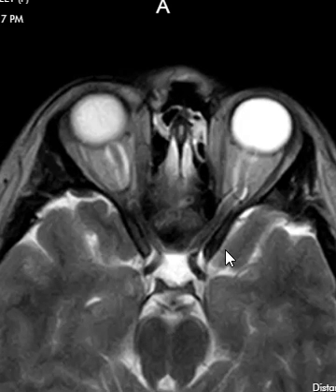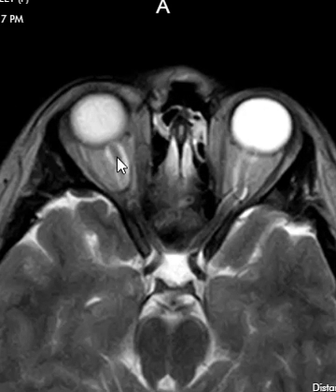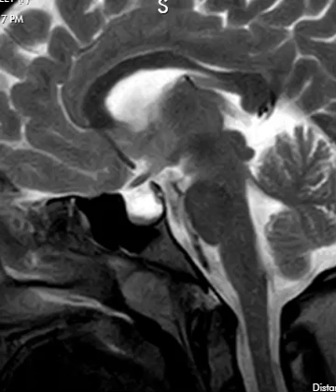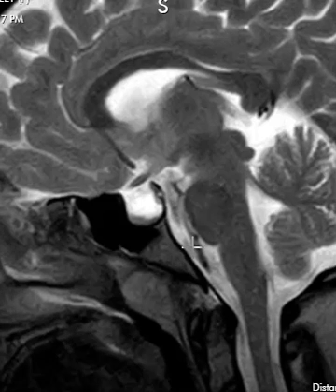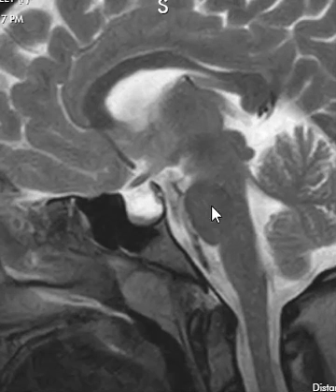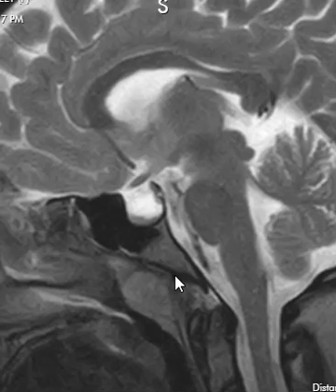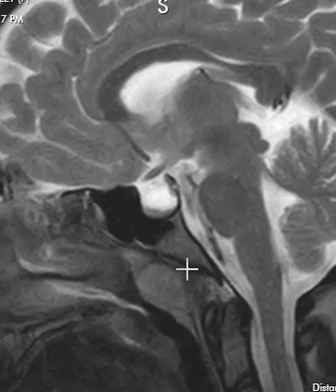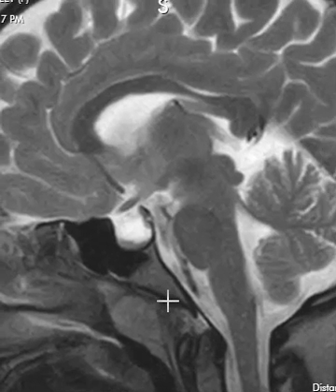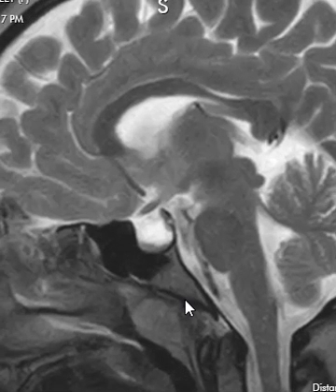This is just an axial view. We can see both eyes, right and left. You can see the optic nerves, and the sheath is distended with fluid on both sides. Back to the midline cut — they also had some prominent adenoids and a large retention cyst in the maxillary sinus.